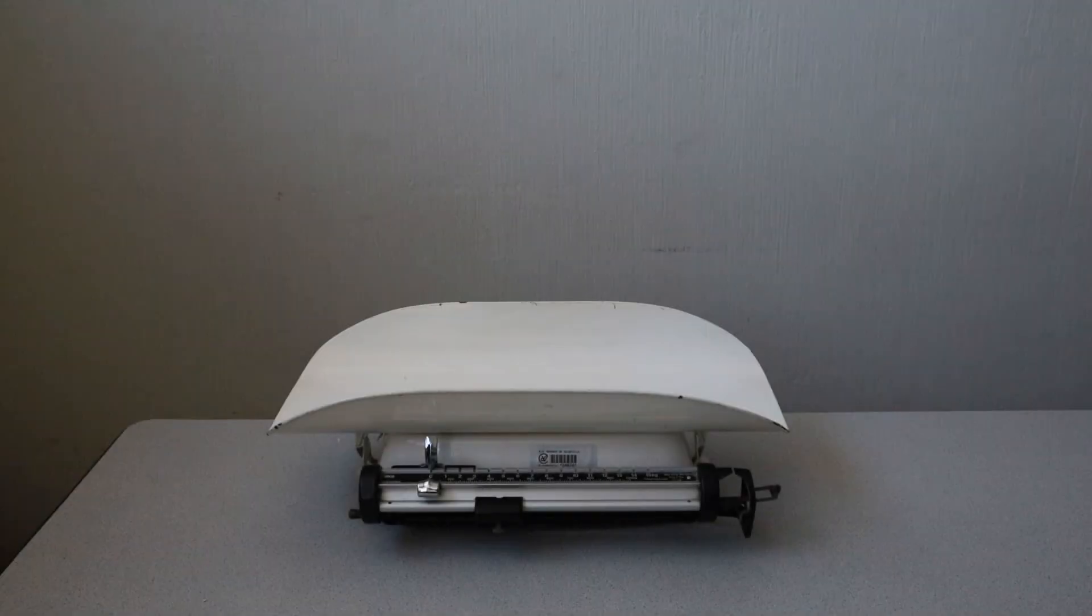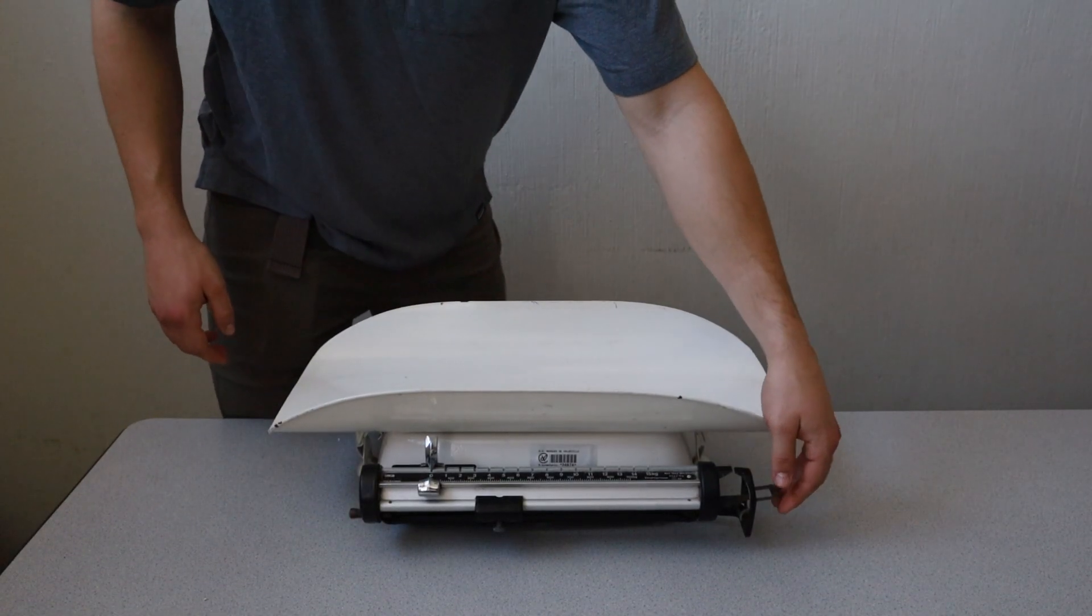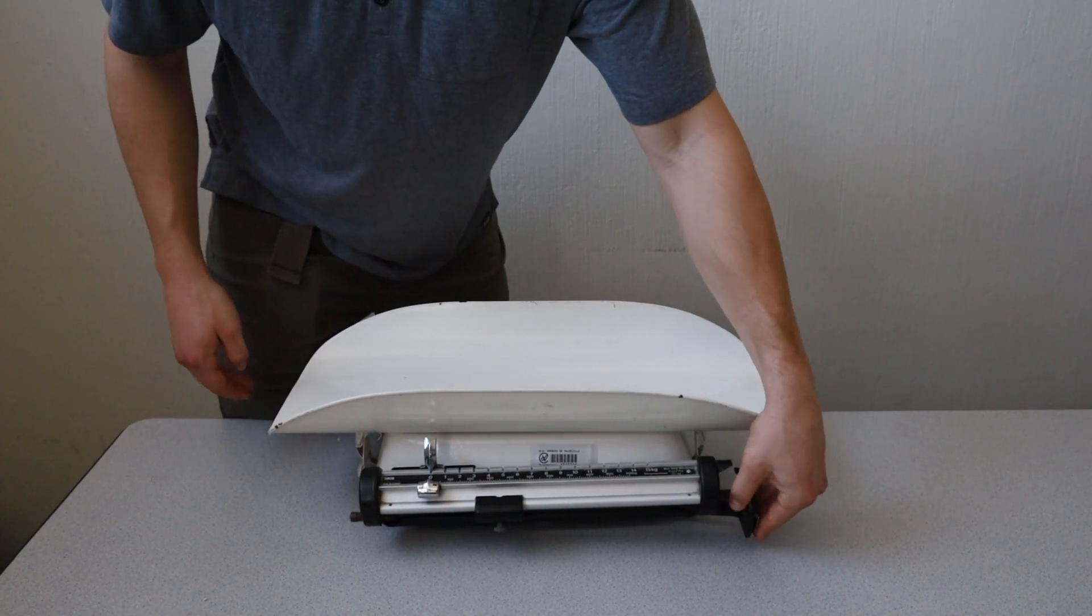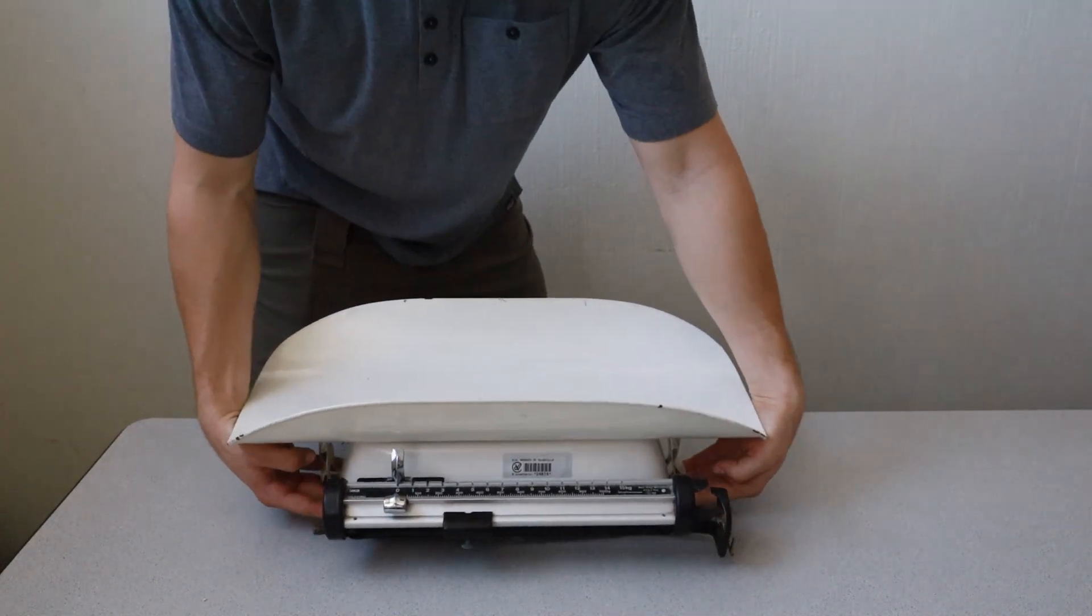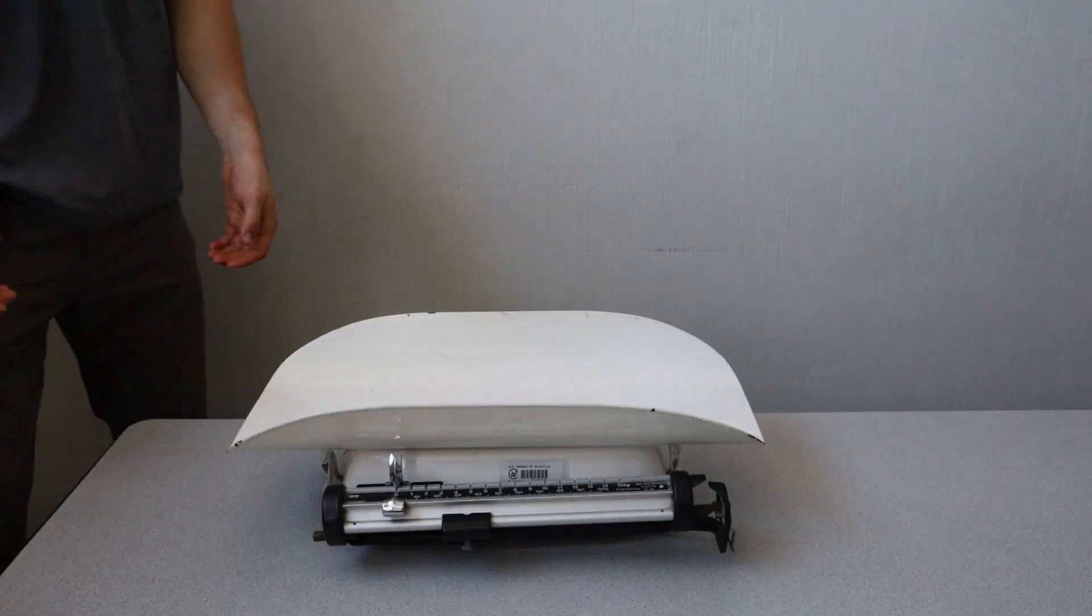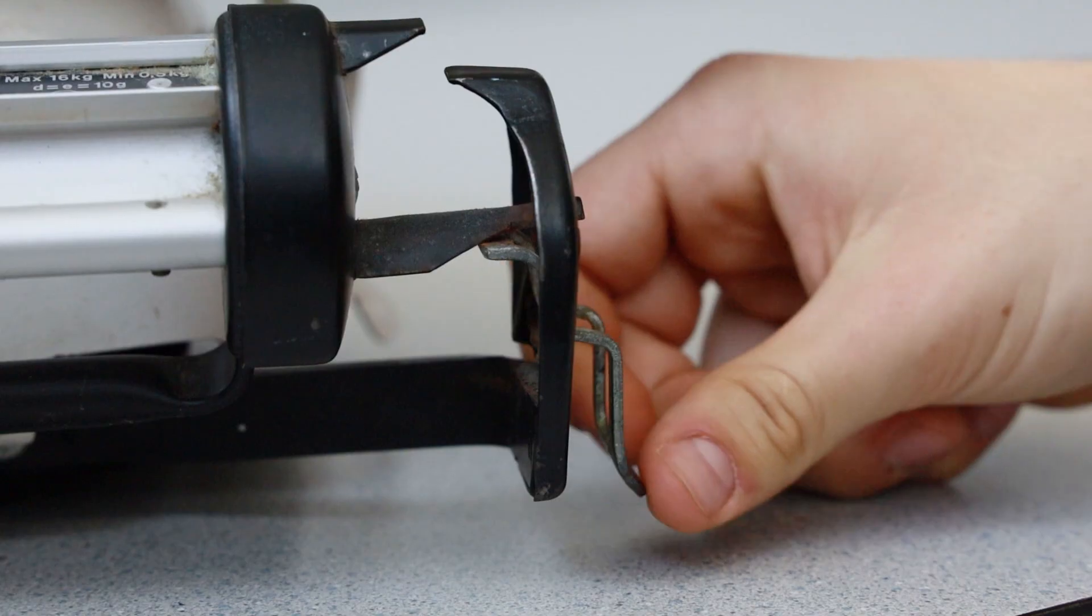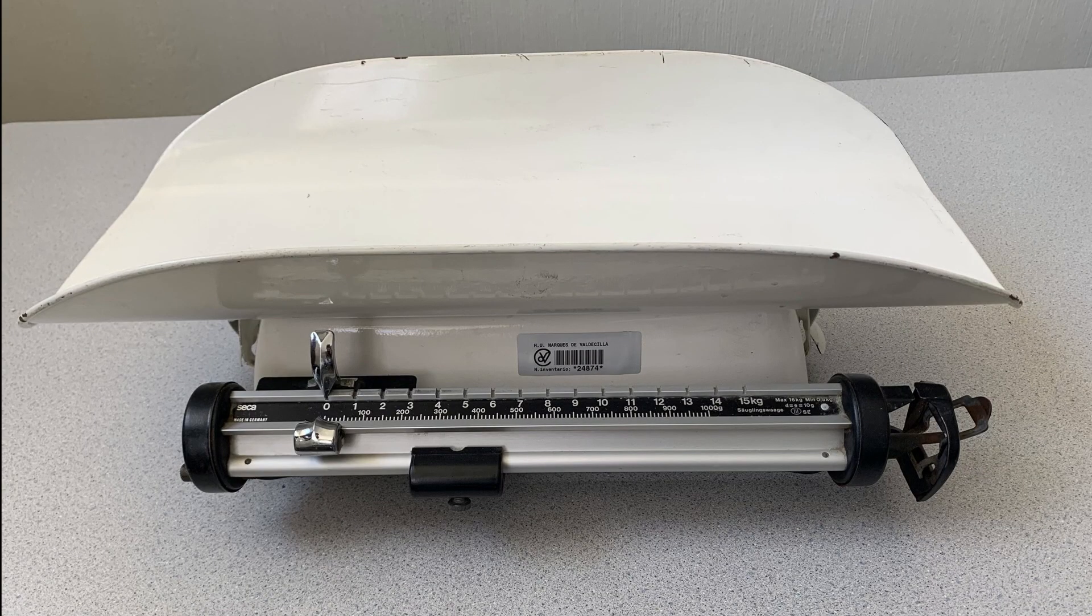It is recommended to clean the scale with a sanitary wipe prior to transport and prior to each use. Lift the scale from beneath with two hands and transport to the desired location, ensuring that the scale is set back on a level surface free of external obstructions. Unlock the transport locks and remove the rubber band securing the weights to begin using the scale again. Calibration may be required prior to using the scale in the new location.